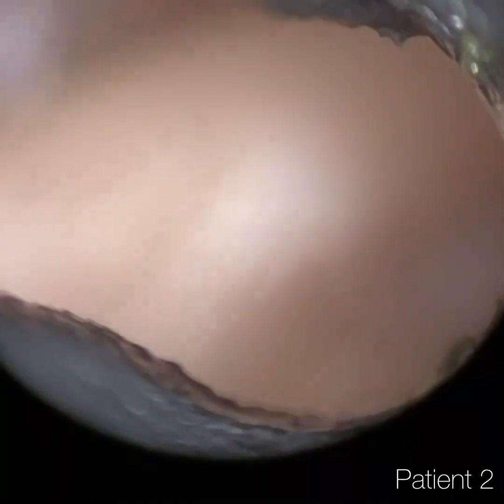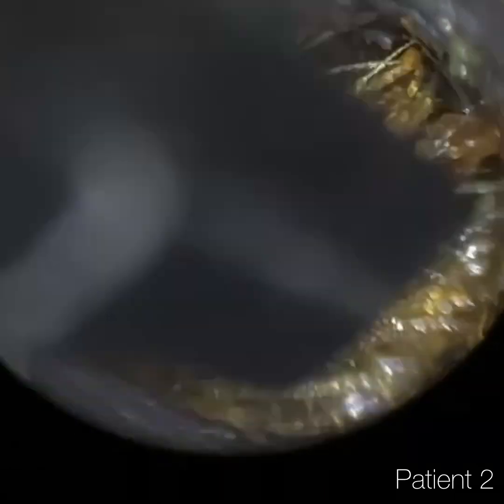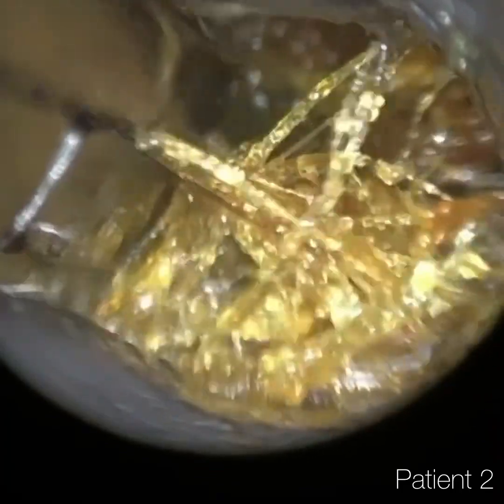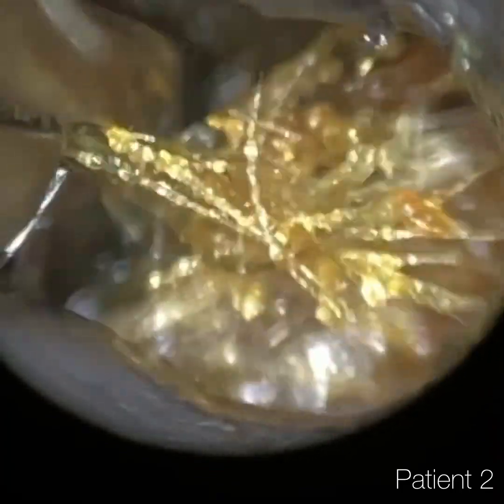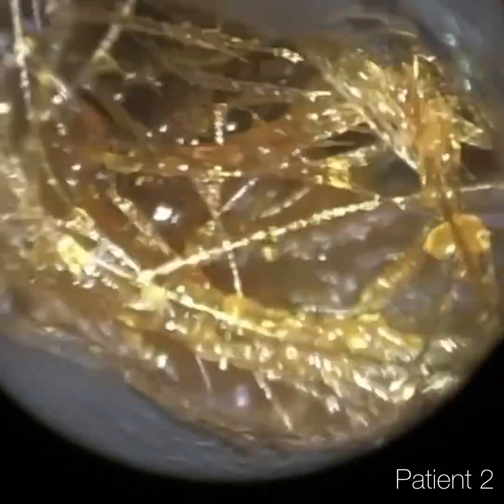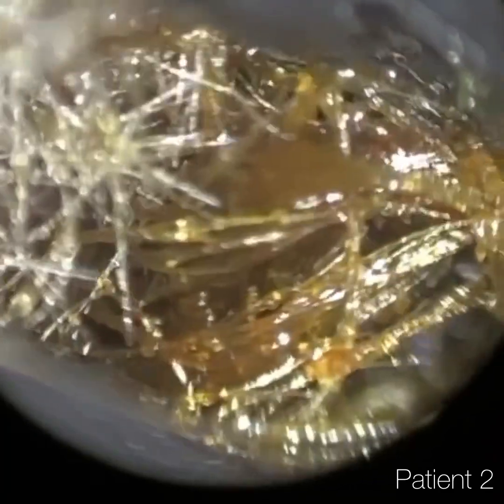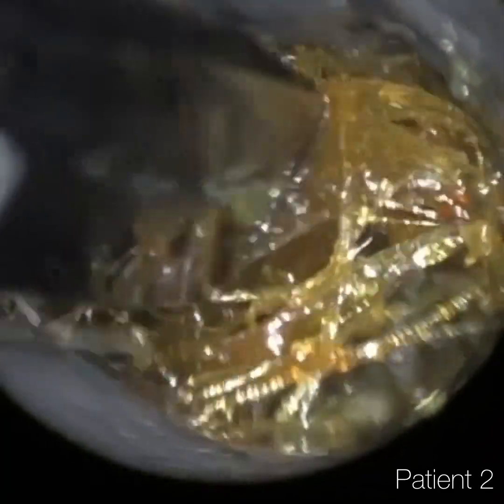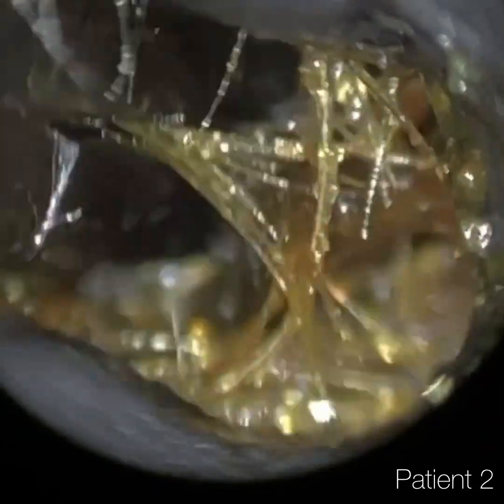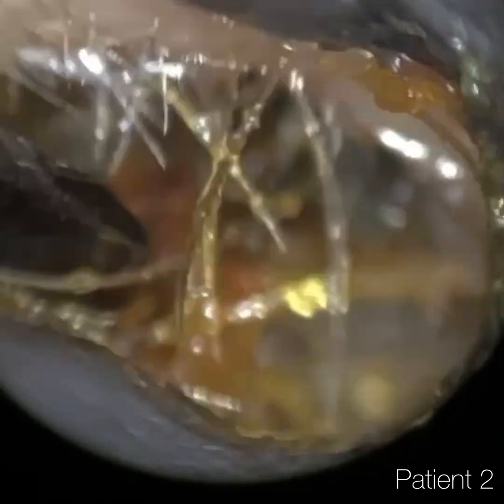So you can see all those hairs matted against the wax. I'm using some forceps now, just to open the jaws and trying to get the jaws over some of these hairs and pulling those out. I've got a still image at the end and you'll see some of the debris and all these hairs. Again, this is what's great with the Waxscope — we're able to use all the ENT micro instruments during the procedure.